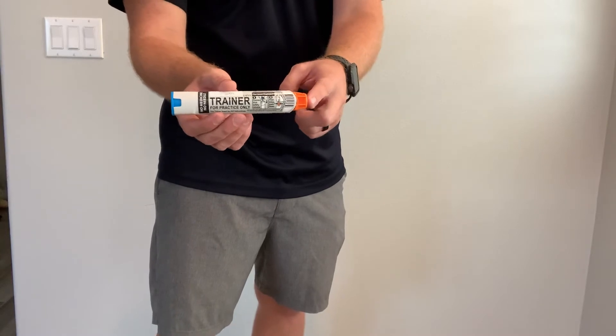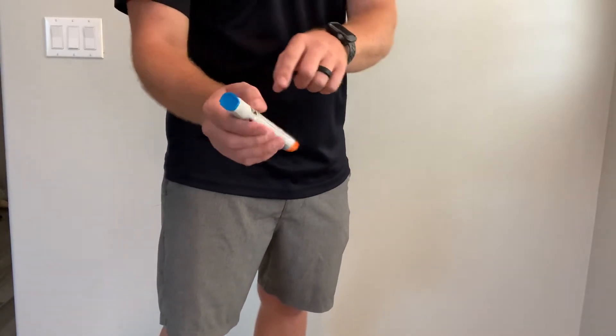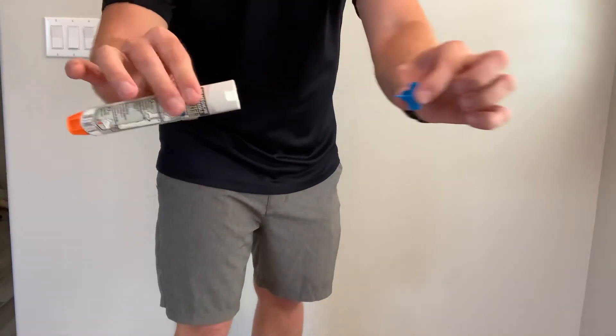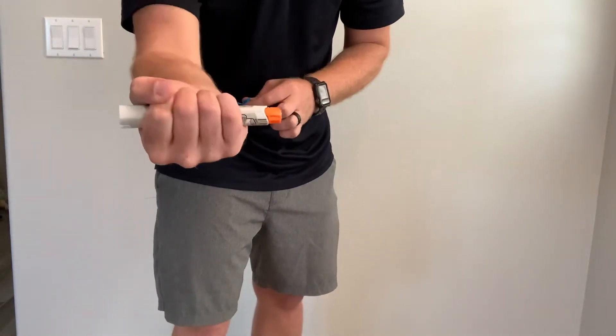The orange side is where the needle comes out and the blue side is the safety. If I have the safety in, nothing's going to happen. If I pull the safety out, then I'm going to grip it really hard in my hand.